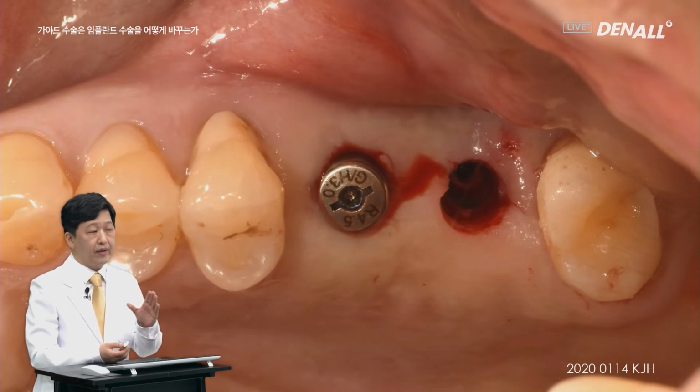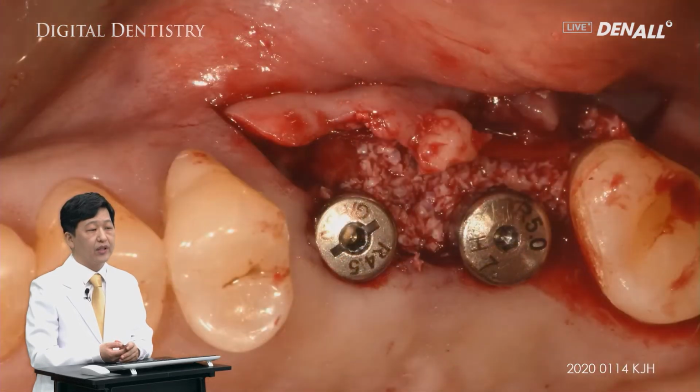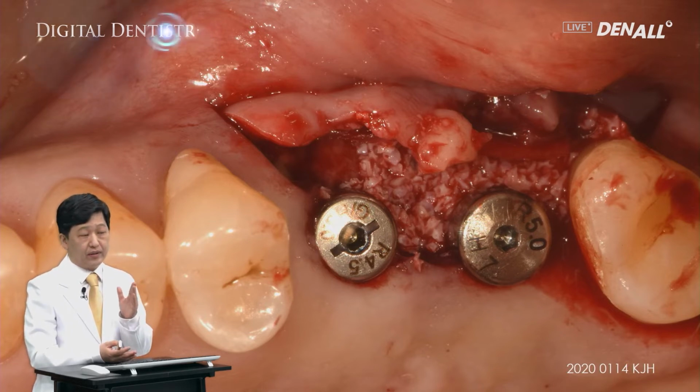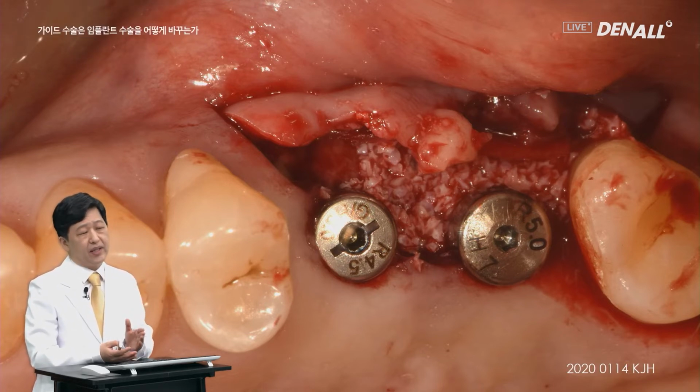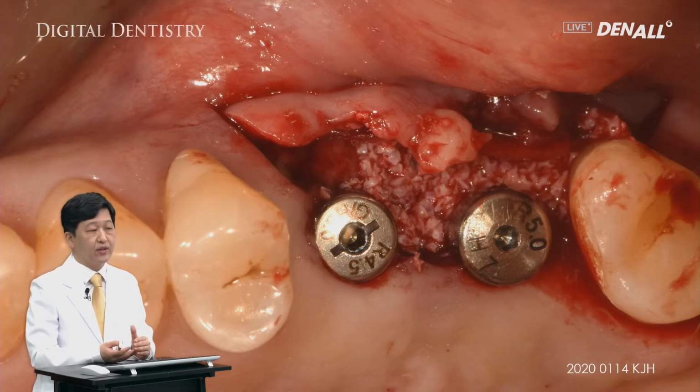Healing abutment was connected to the mesial implant, to the distal implant. The flap was reflected once again. On the buccal defect, bone graft is done. In this case, if I had not used a guide and used the traditional method in placing the implant, the implant would have been placed more palatally. There would have been such tendency because you feel the urge to use more residual bone and to avoid the dehiscence or fenestration on the buccal side.